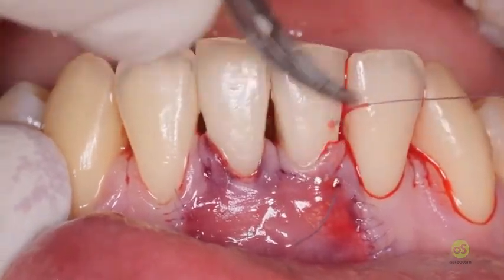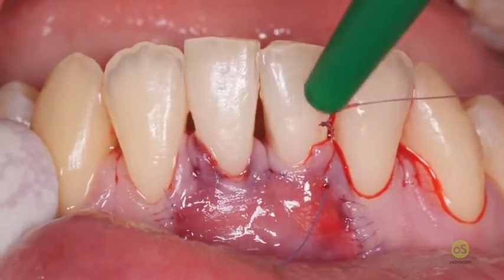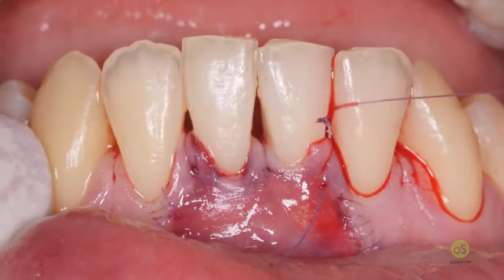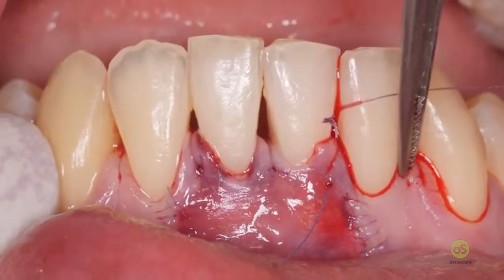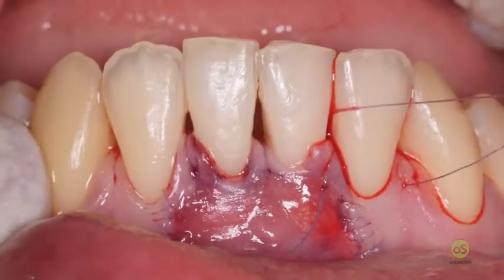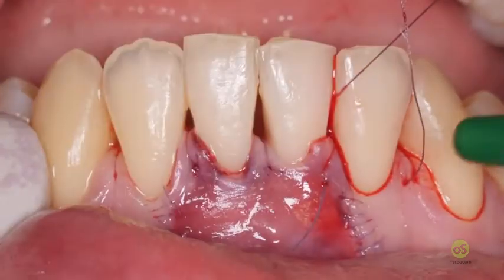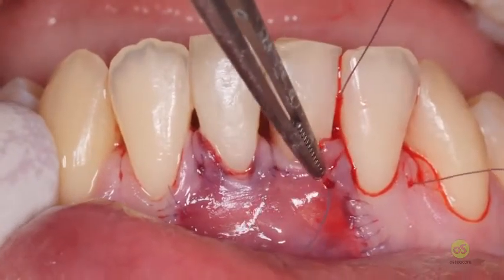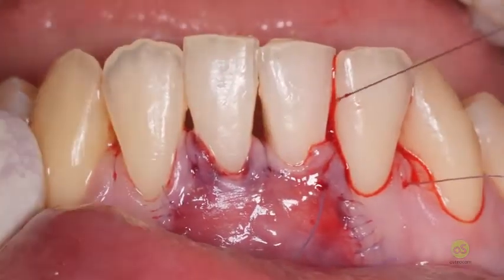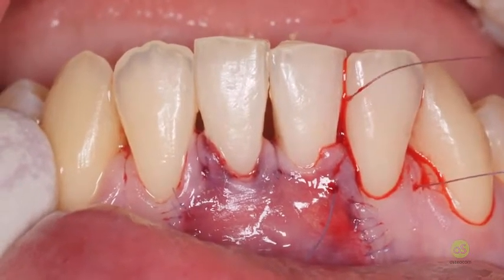From the previous one, the papilla stays there. The previous suture can be removed. I will remove the remaining part of the suture later, and then once the papilla is already in the final position, I try to do it better than before, but now with no tension. That's the physiological.